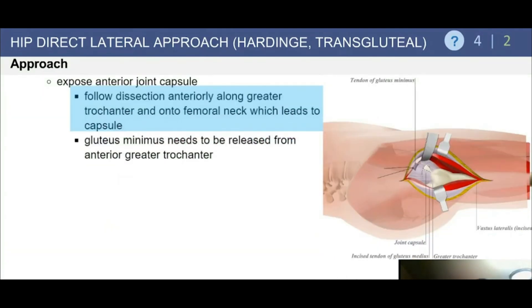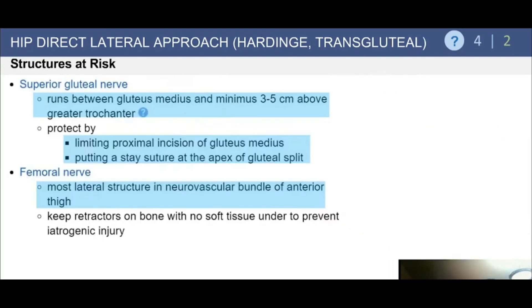Expose the hip joint anteriorly, follow the dissection, and make your capsulotomy. At this point you should have exposure to the femoral neck.